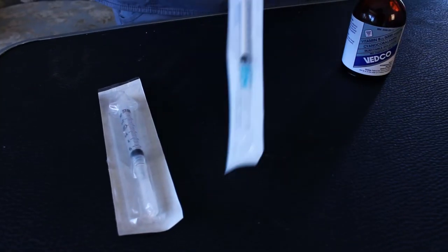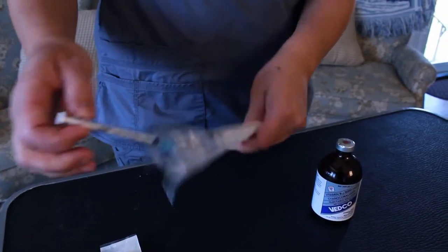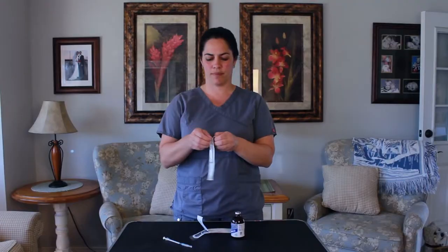Most of the syringes come in packages. First thing you're going to do is open the package. I like to make sure the needle's on tight, so I usually do a little twist to make sure the needle's on tight. Open your plastic and make sure your needle's nice and tight.